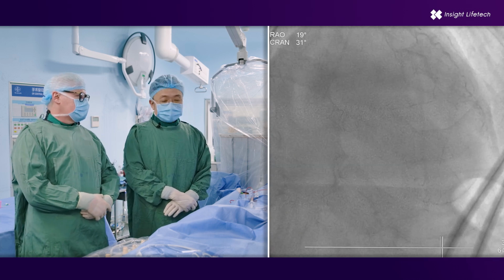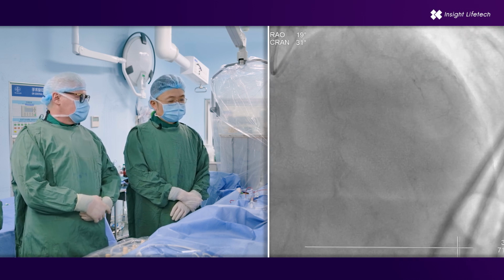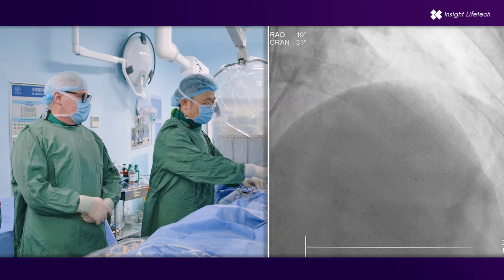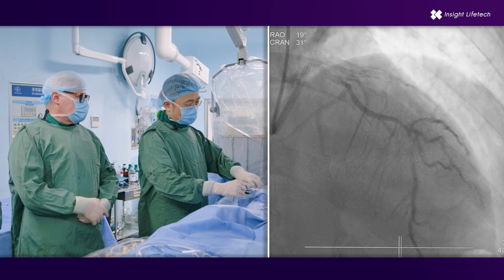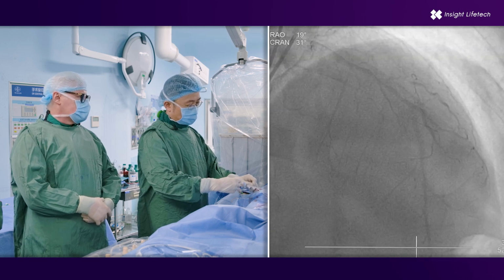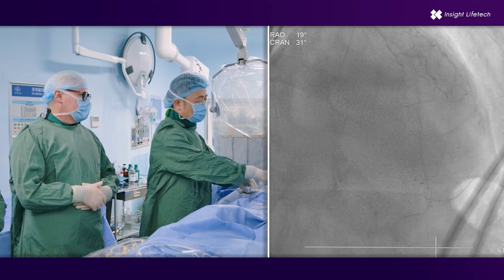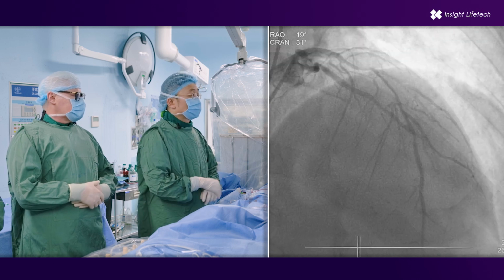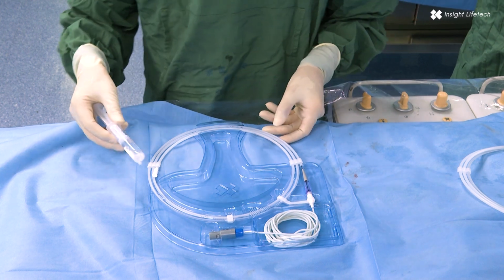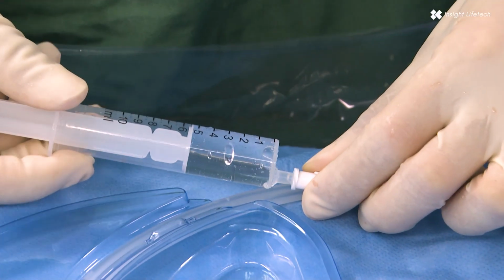We discussed this extensively, how to treat this patient, and our decision was first to do it with physiology and intravascular imaging guidance, to achieve as good a result as possible according to ischemia, but also to optimize our stenting procedure. So maybe we can go immediately to wiring of this vessel, and then we will start with physiology. Okay, our fellow already wired this vessel with a Samurai, and now we start the FFR.